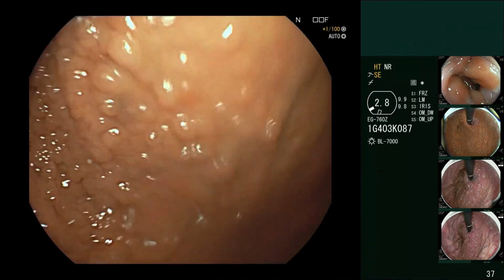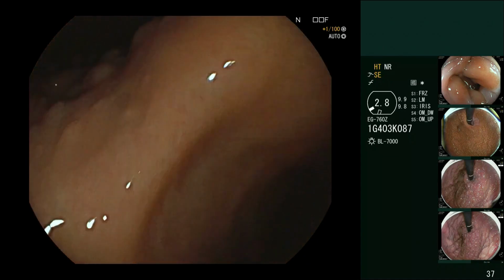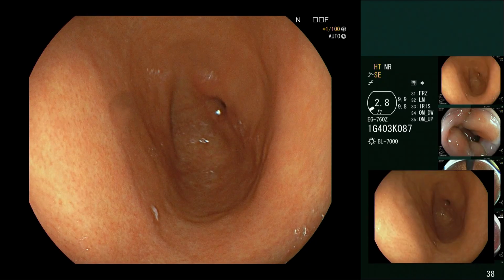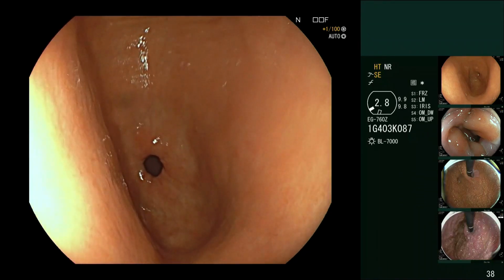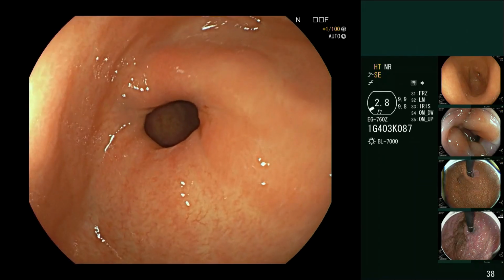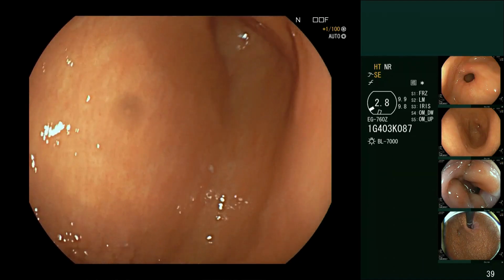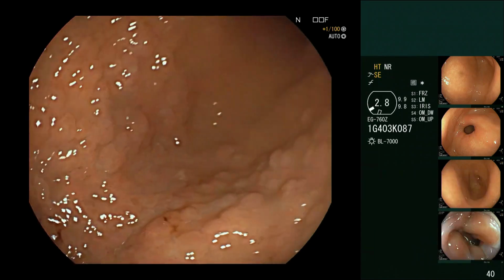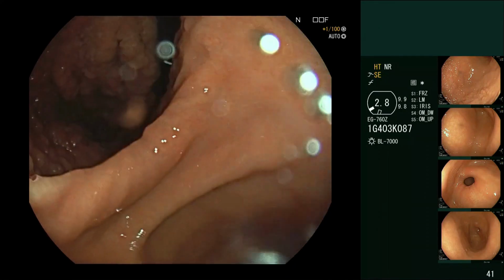Okay, and then once you've done the photographs, let's just take some standardized ones to show you how you should do it. Here we have it, like this. Maybe you want to go in closer, maybe a little bit. Maybe you want to take a close-up of the pylorus. Maybe you want to come back and give a view of the part that is abutting the greater curve in white light.